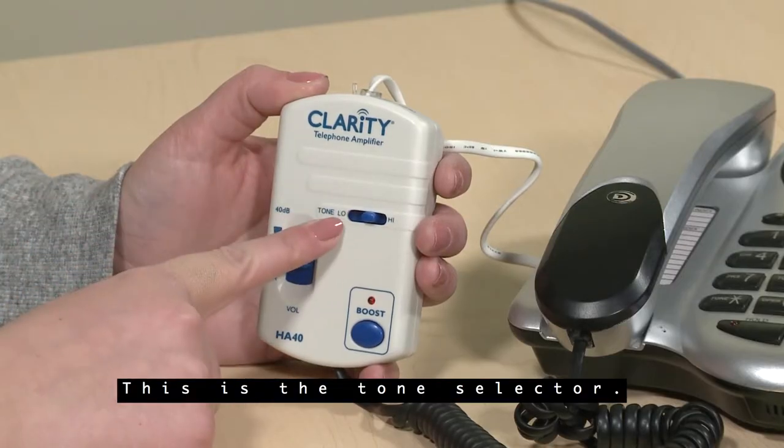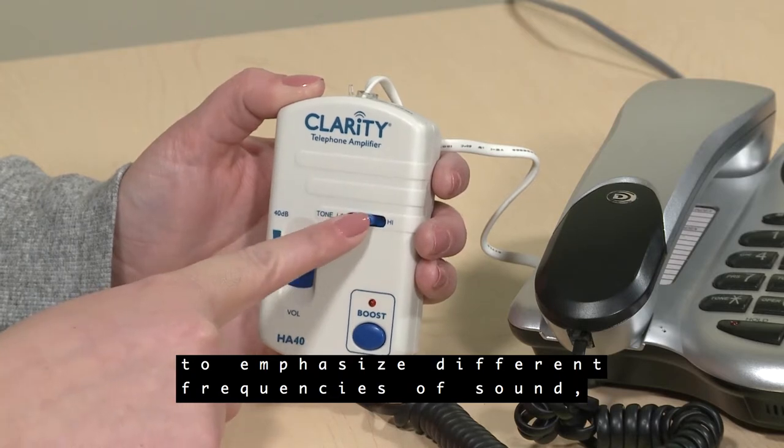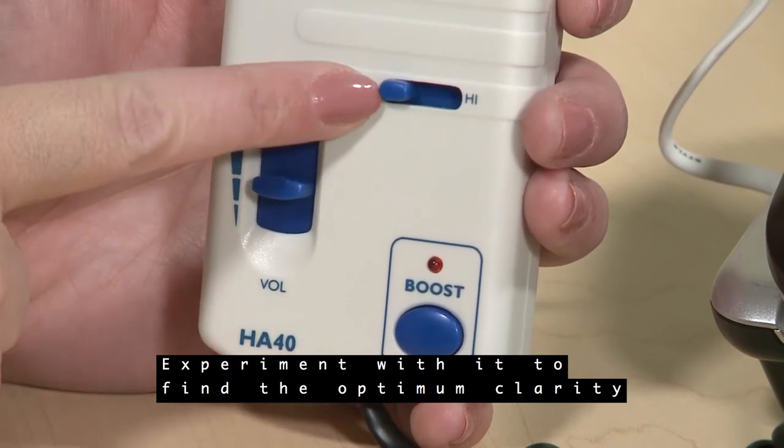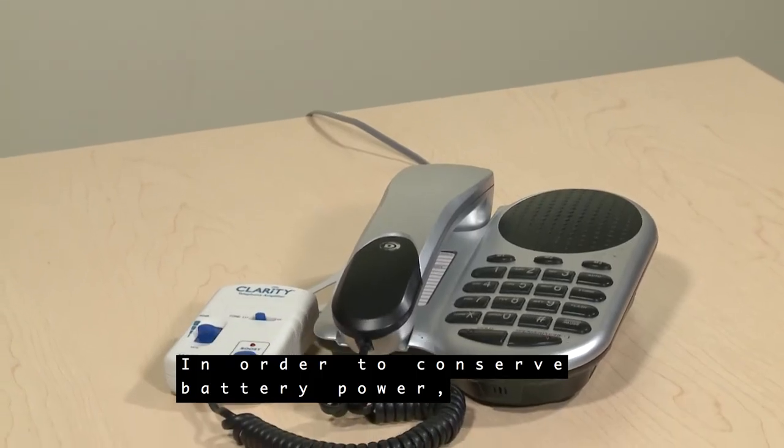This is the tone selector. Slide it left to right to emphasize different frequencies of sound — lower sounds or higher. Experiment with it to find the optimum clarity for your hearing.